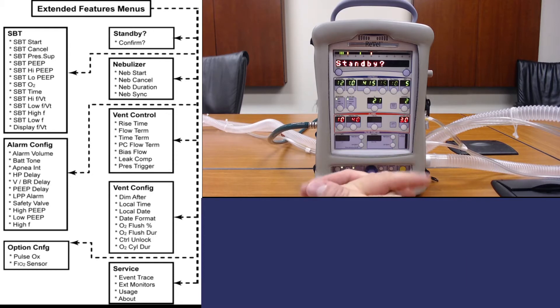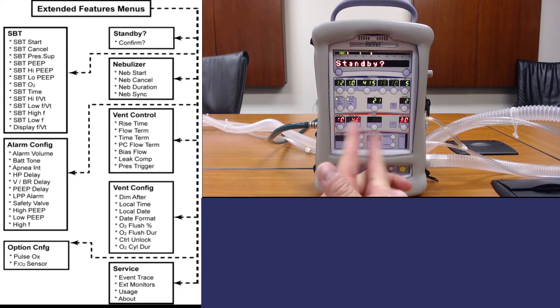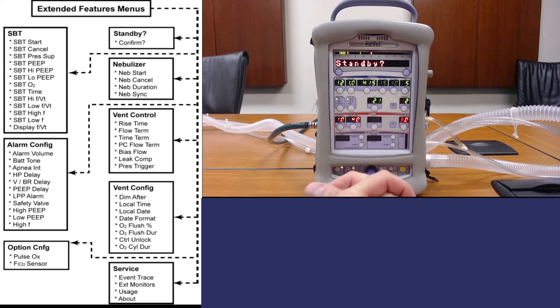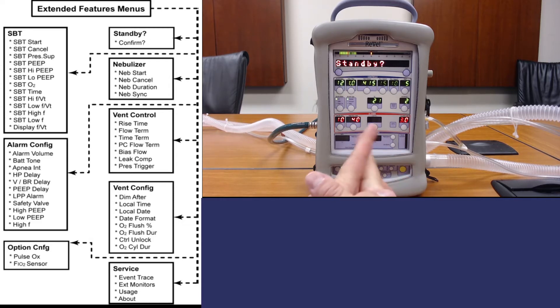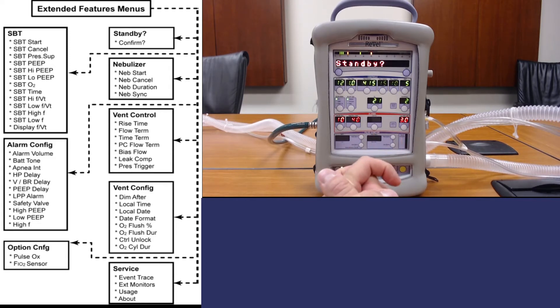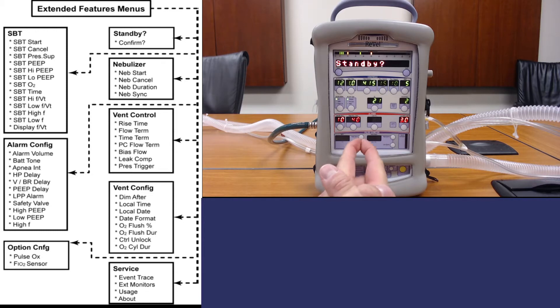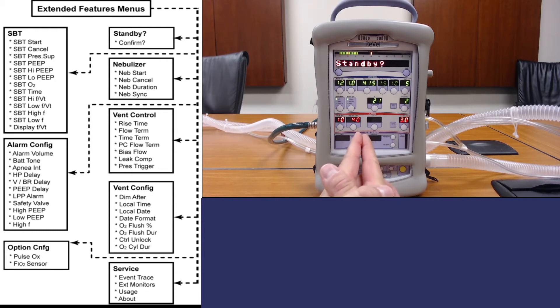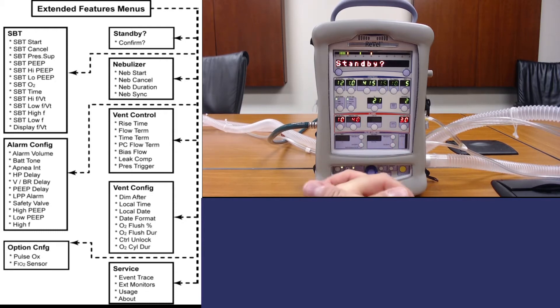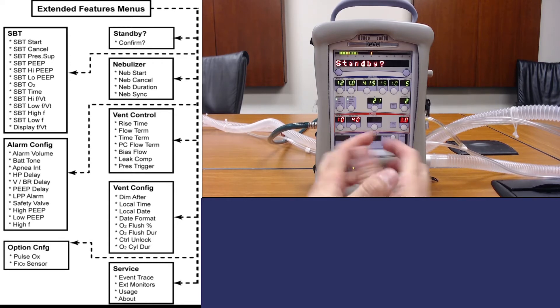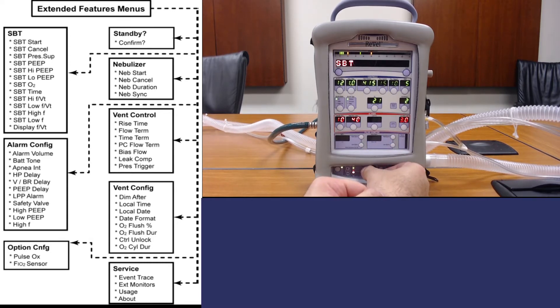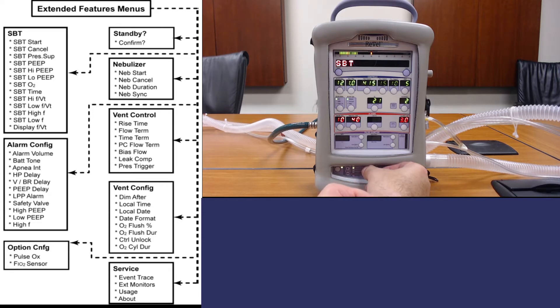The ones we're really going to focus on are standby, which puts the ventilator into standby mode while ceasing actual vent operations but leaving the unit turned on, nebulizer, and vent control. The other menus really aren't necessary to utilize for daily use of the ventilator.